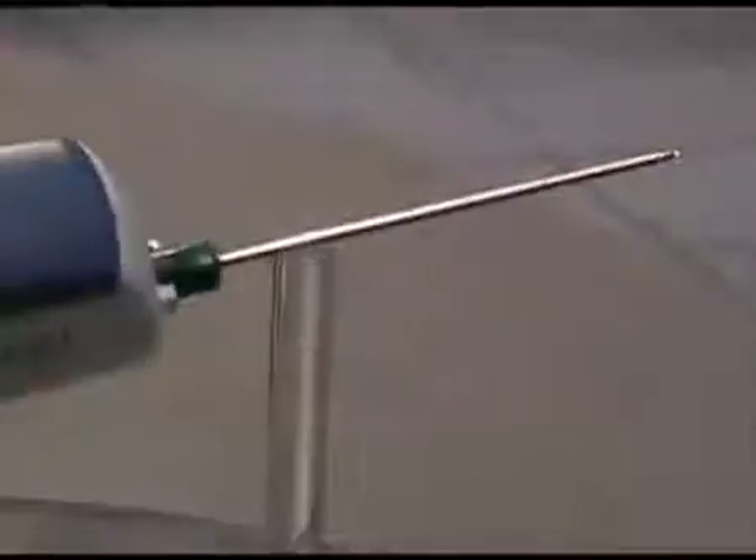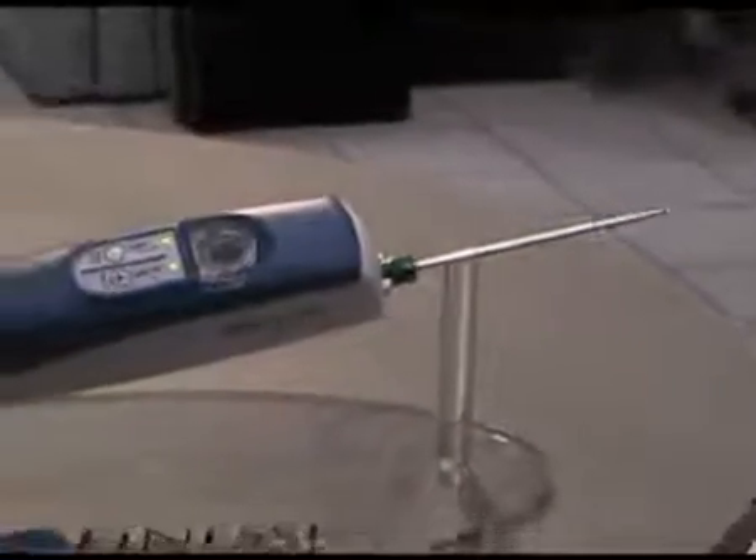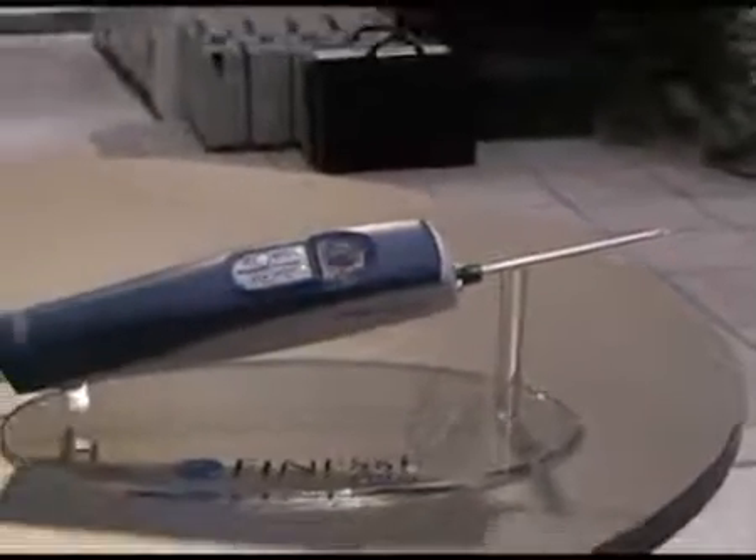Its ultra-sharp cutting tip and optional piercing mode allow for accurate penetration of dense breast tissue and lesions without displacing the lesion. Utilizing its integrated coax system, you can leave a track to the biopsy site through which a breast tissue marker can be deployed.